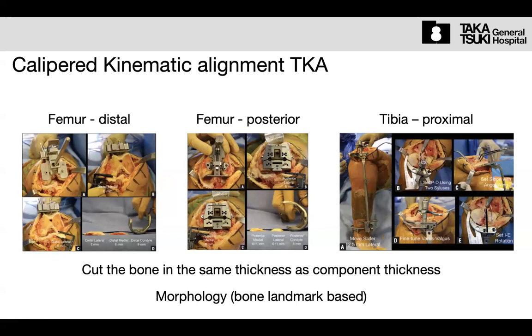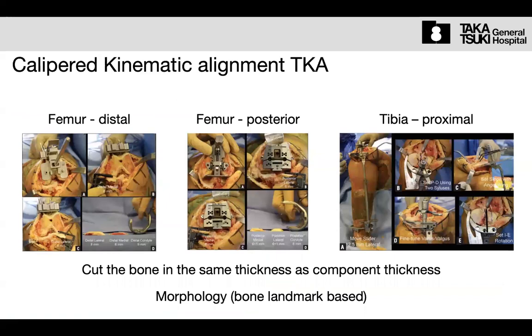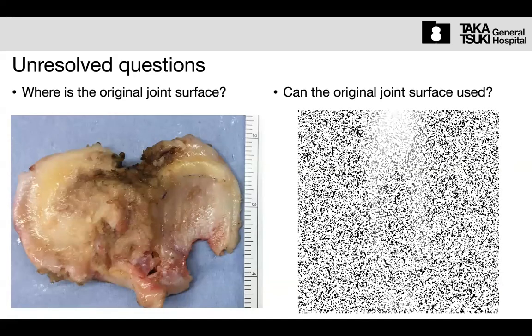No, it's a kind of soft tissue respecting approach. But anyway, if we cut naively to follow the articular surface, the alignment is sometimes too extreme. For example, 10 degrees in varus or 12 degrees of posterior slope. So this is a very difficult question.